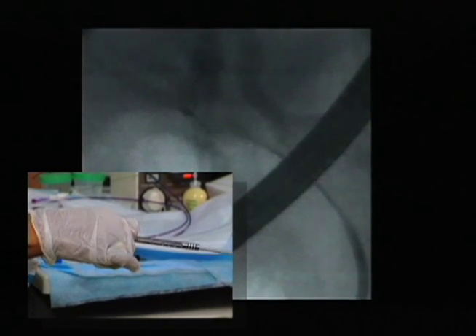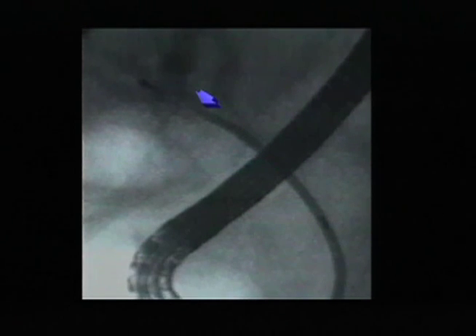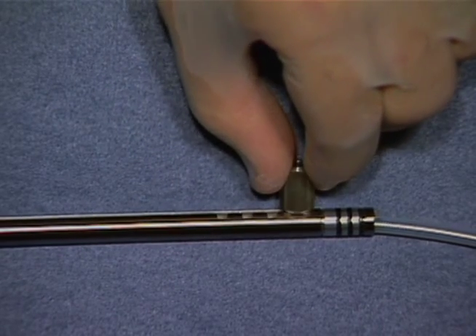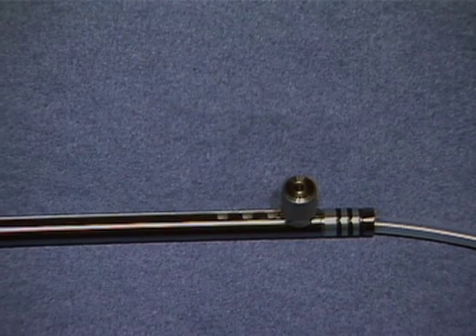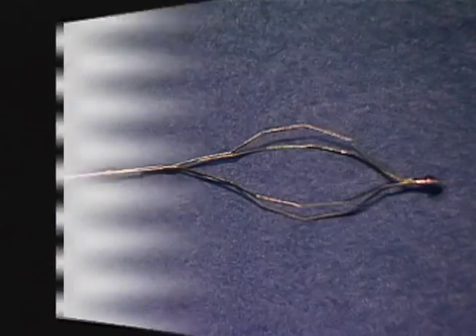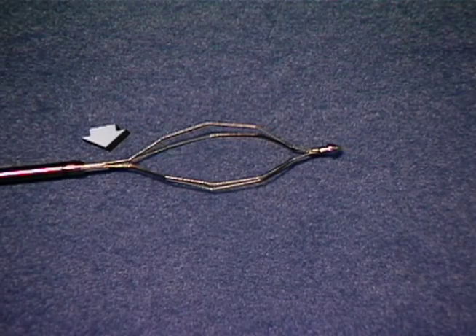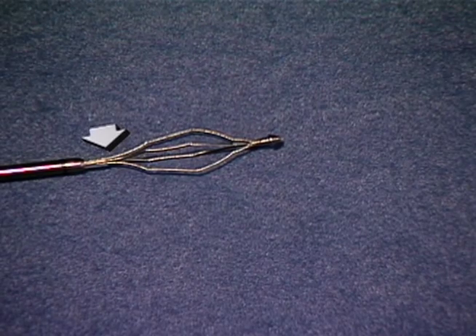Ensure that all personnel involved are familiar with the procedure. Visually confirm that the Teflon sheath is fully covered by the coil sheath. Then push the knob of the slide region into the groove closest to the distal tip and securely fasten the coil sheath by tightening the knob. Confirm that the knob is securely placed in the groove and fully tightened. If the Teflon sheath is not fully covered by the coil sheath, it may be damaged when crushing a stone, preventing the Teflon sheath from being drawn into the coil sheath.